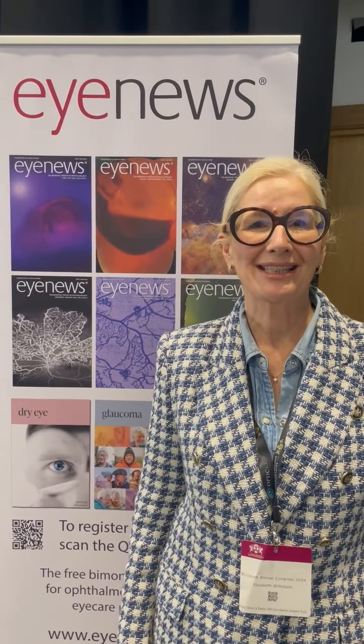Hi, I'm Liz Wilkinson. I run the high volume cataract unit at Exeter at the Centre of Excellence for Eyes, which is in our old Nightingale COVID hospital. We use a Surgicube mostly because it's an old home base and we just didn't have the ceiling height to put in a new theatre.